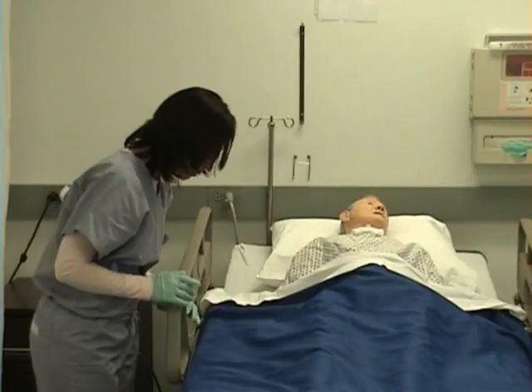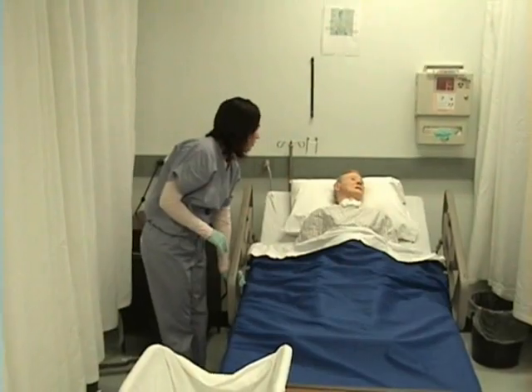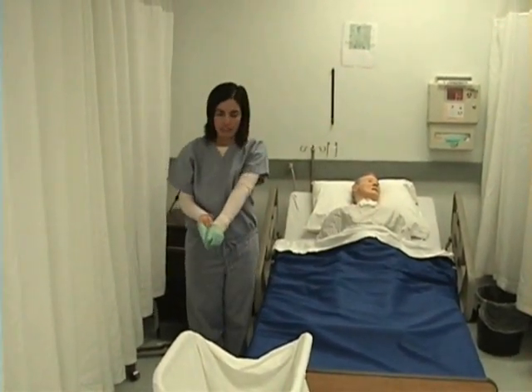I will now raise the head of her bed and put the bed in the lowest position. I will now remove my gloves and wash my hands.